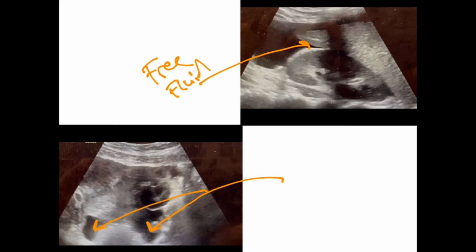So you wheel in your ultrasound, you put the probe on the right upper quadrant, and you immediately see free fluid. You get the pelvic view, you see more free fluid. In fact, this might actually be an ectopic pregnancy we're seeing there. So now you have a tachycardic pregnant patient who's in shock with a positive FAST exam.